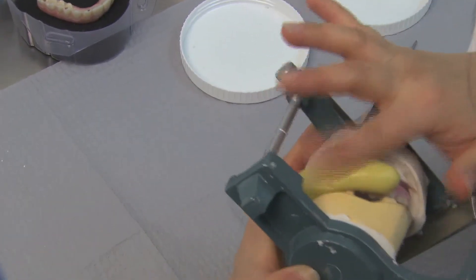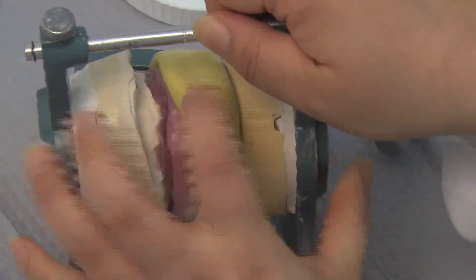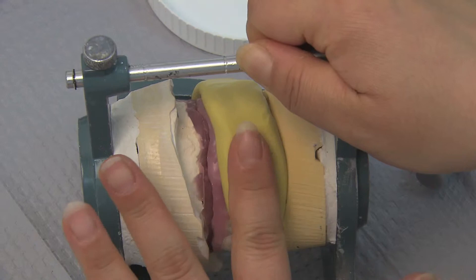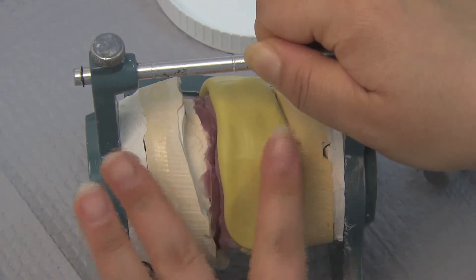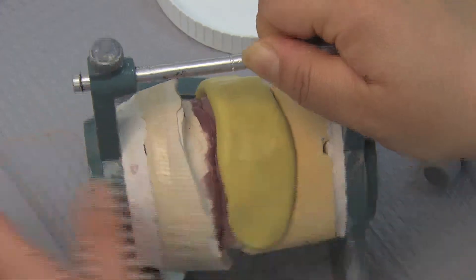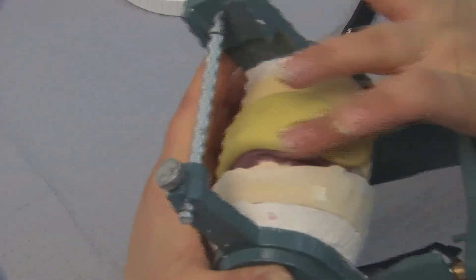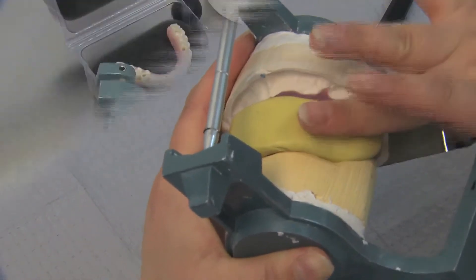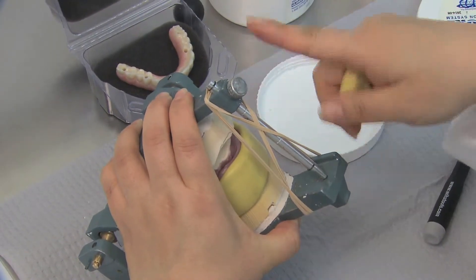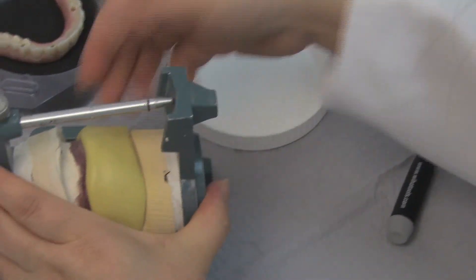The putty is extended to cover a few millimeters of the soft tissue on both the upper and lower arch. Rubber bands are recommended to keep the bite closed while the putty sets. After waiting three minutes for the putty to set, the now hardened putty is removed and inspected for defects.